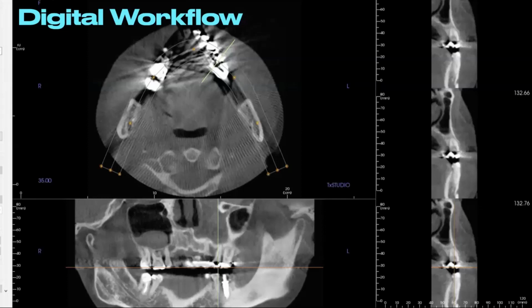if a patient ever has an issue, it's the same reason why I say when you see a restoration, a crown on a tooth, or do a filling or anything on an implant, you take an x-ray. And the reason being is you can imagine, and all of you, I'm sure, have experienced this. Someone comes into your office, they're having a problem with a tooth. You've never seen the patient. They recently got a filling or a crown or something. The first thing you're going to do is take an x-ray. And the reason why you take an x-ray is so you can see what's going on. Well, if you don't have a baseline from what it was like before, how do you know something's changed, right?